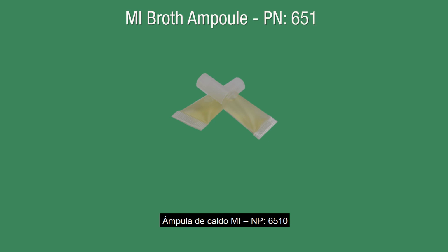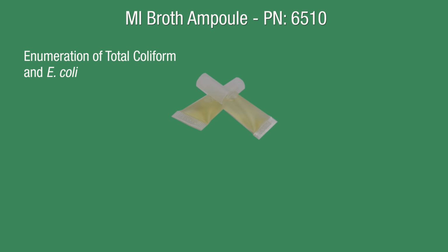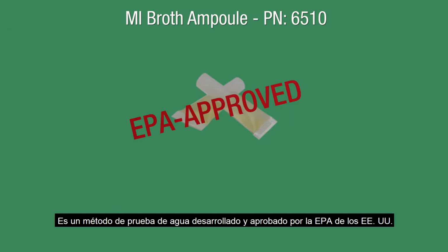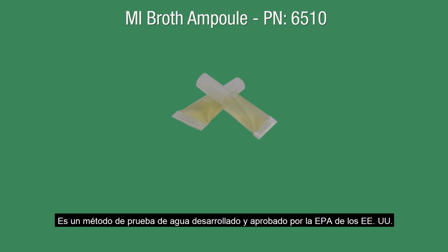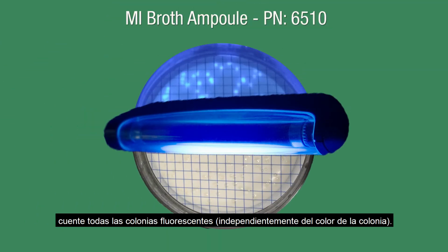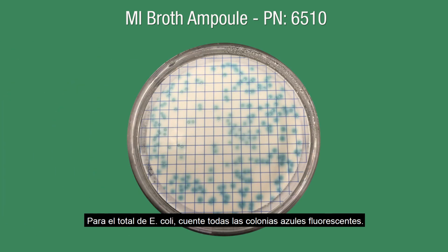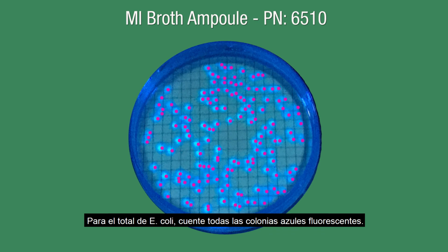MI broth ampule. This medium is for the enumeration of total coliform and E. coli. It is a U.S. EPA developed and approved water testing method. To interpret results for total coliform, count all fluorescing colonies, regardless of colony color. For total E. coli, count all blue fluorescing colonies.